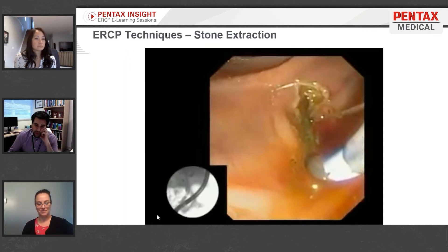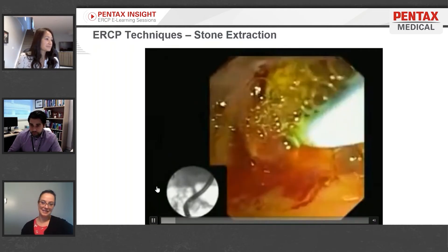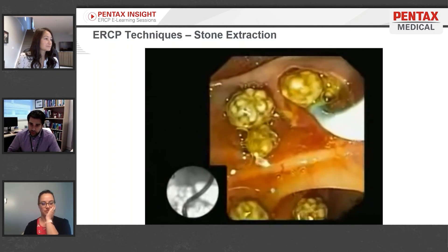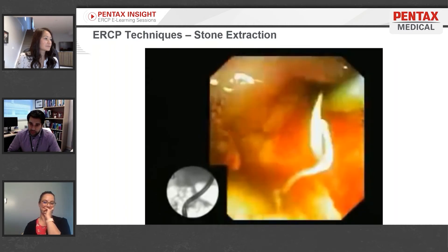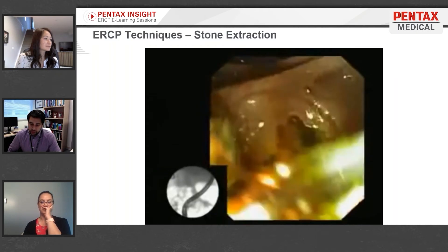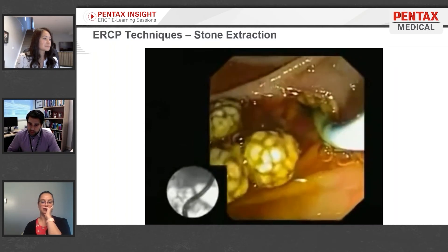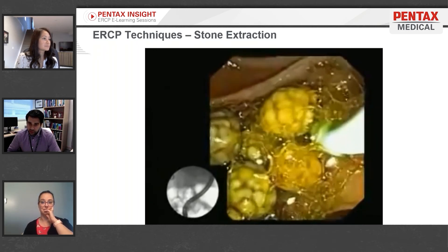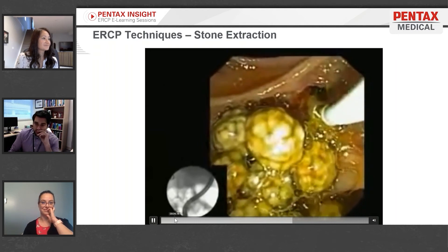Here's a video of stone extraction using just a simple extraction balloon. After achieving biliary access and doing a sphincterotomy, they go in with a stone extraction balloon and dredge out the stones. The balloon is inflated and then deflated, and they go back in to sweep a couple more times. The opening is nice and big because of the sphincterotomy, and there are tons of stones being dredged out by inflating the balloon.